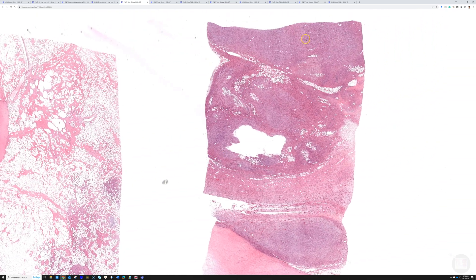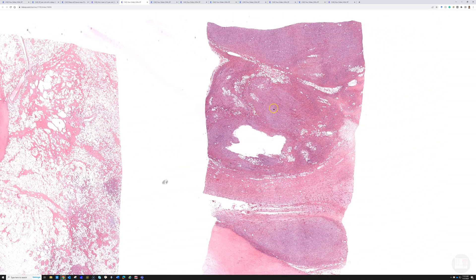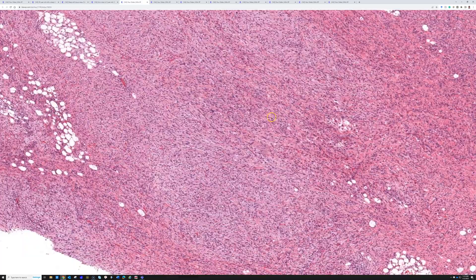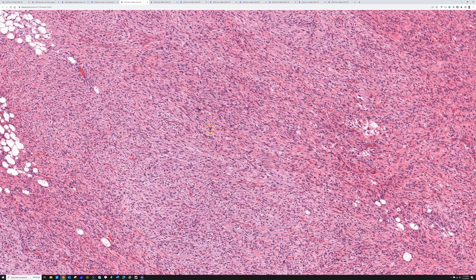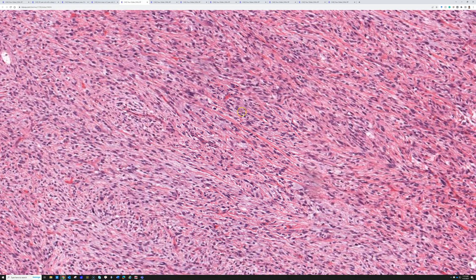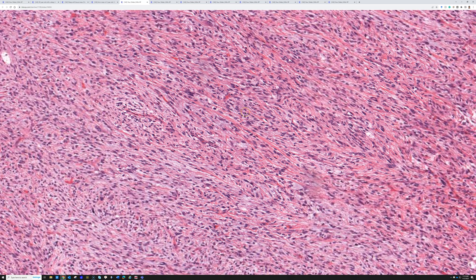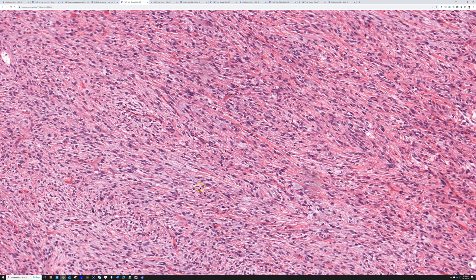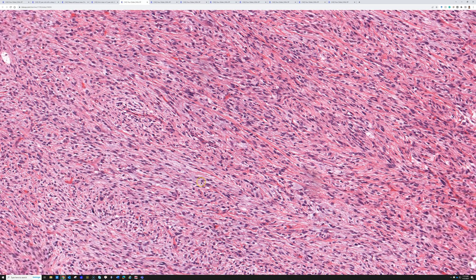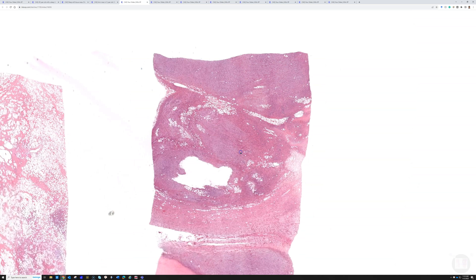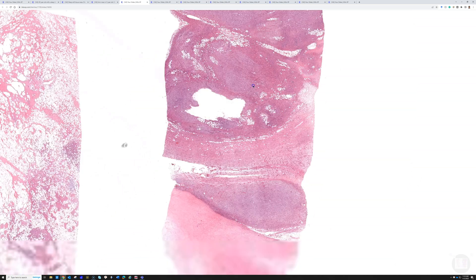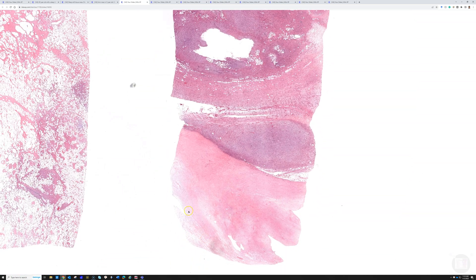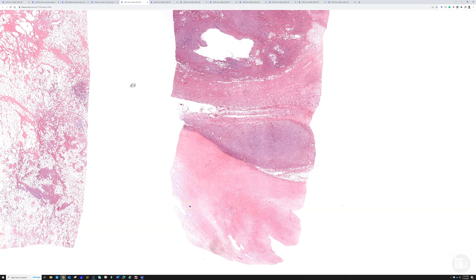Right away, we can see it's a hypercellular tumor of atypical spindle cells. In this case, they're arranged in fascicles with some myxoid, blue myxoid background.